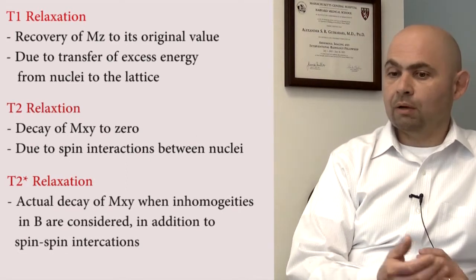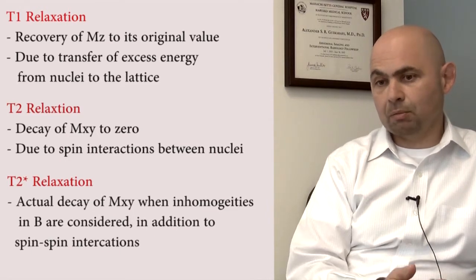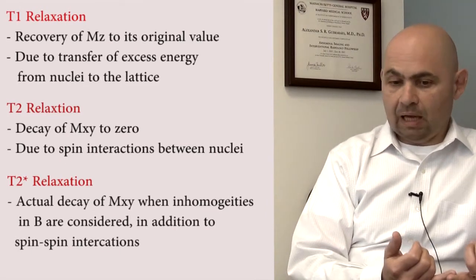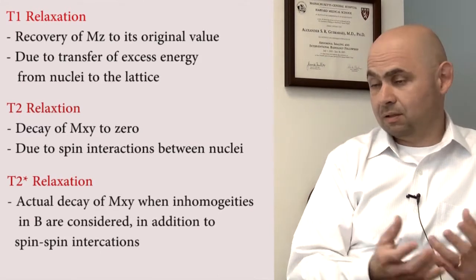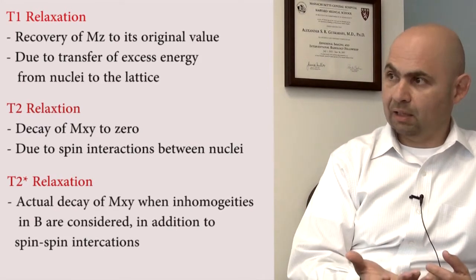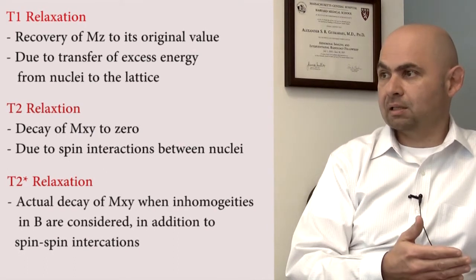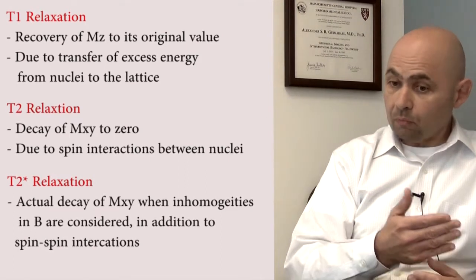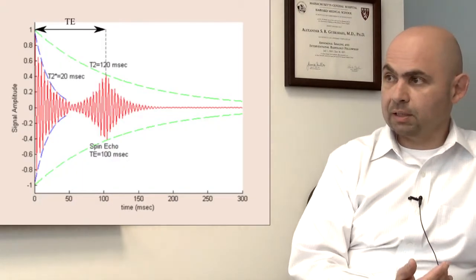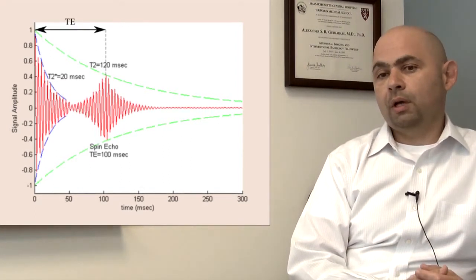In addition, when you have gas or anything that causes what's referred to as susceptibility change, meaning gas, which cannot have magnetization because it's gas, essentially, so it has no magnetization, anytime you have a very sharp gradient in magnetization, you will cause a loss of coherence of magnetization. So gas, bony interfaces, and metal all cause this.